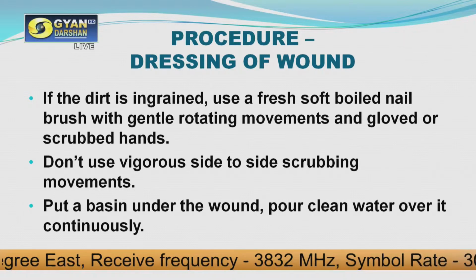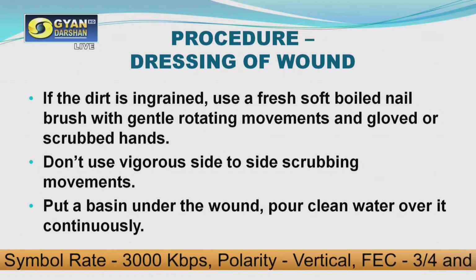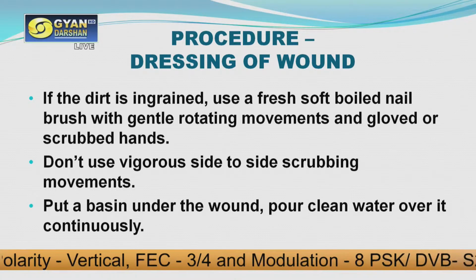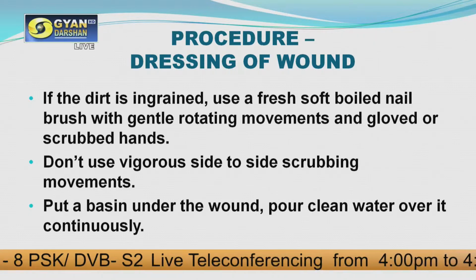Do not use vigorous side to side scrubbing. As we told, do it in a circular motion rather than side to side scrubbing movements. Then put a basin under the wound and pour clean water over it continuously. It is very important to clean the wound using tap water and soap, or you can use water in a basin to clean the wound.